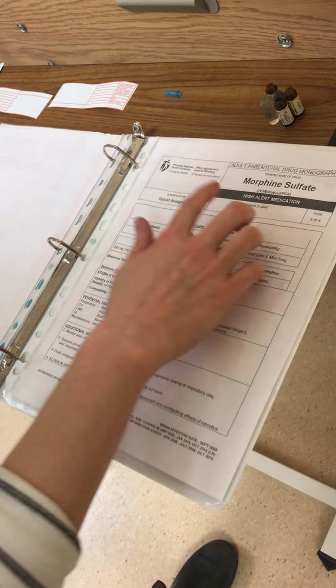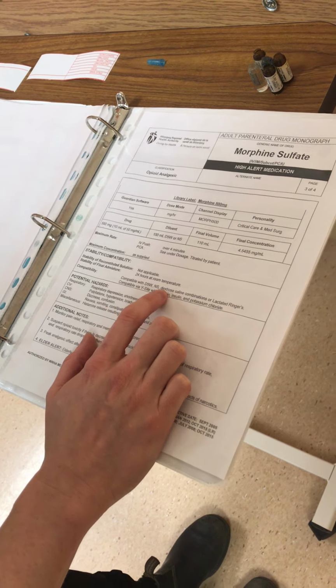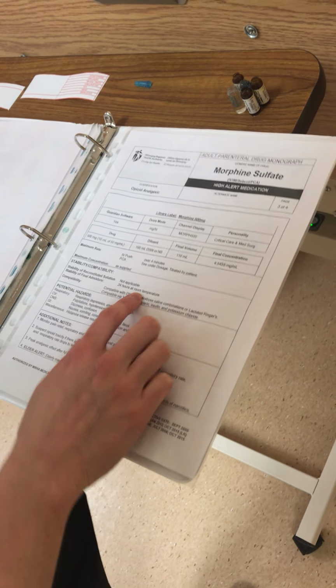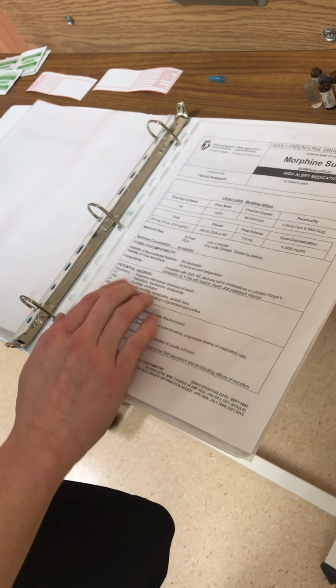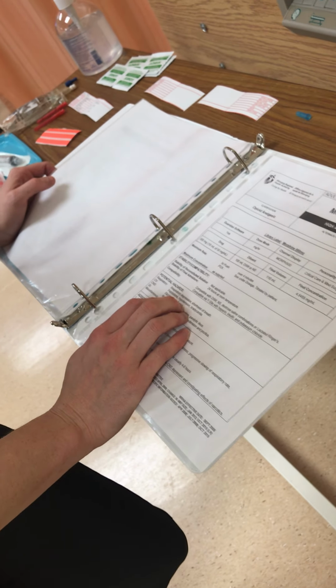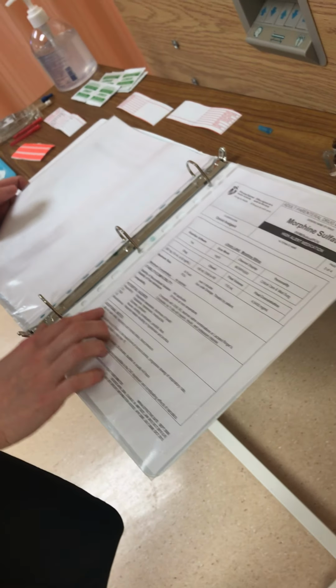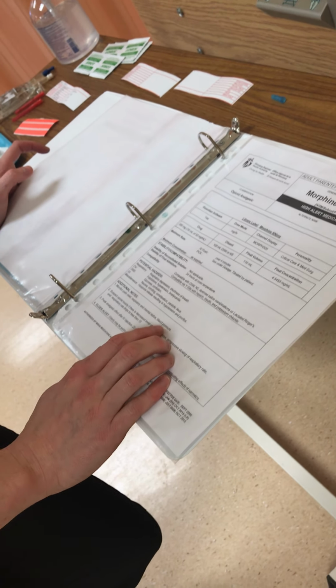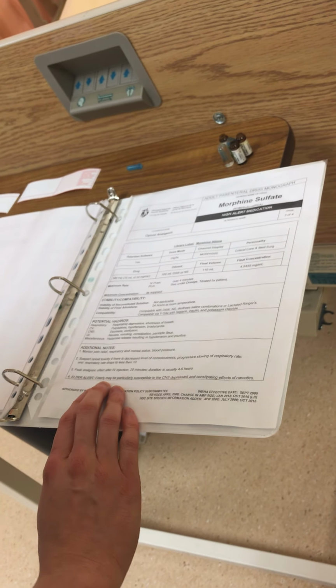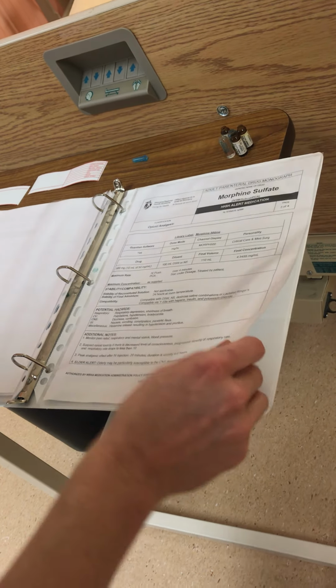I recognize that this medication is compatible with D5W and normal saline, which is good because I will be mixing it with normal saline. I recognize the hazards of this medication as an opioid: respiratory depression, shortness of breath, and all the rest. I will monitor my patient for these. I'll be using this medication to help relieve the patient's post-surgical pain. I'll be monitoring vital signs such as blood pressure and respiratory rates. I will also have Narcan on hand in case of opioid toxicity, to reverse the effects of the morphine.